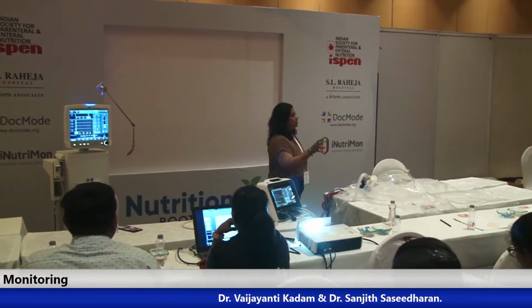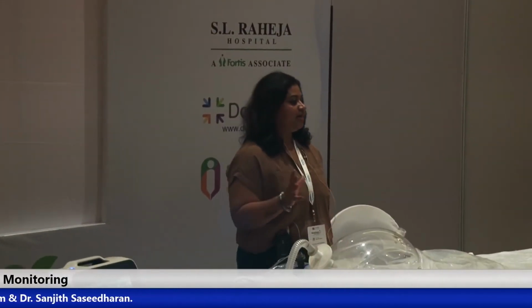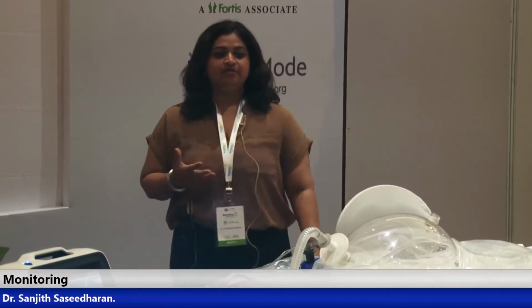Has anybody worked with it or seen or heard about it? Okay. What is indirect calorimetry? So something which will judge the calories, it doesn't judge, but it estimates and measures the calorie. That's the difference. Okay. What we usually do is we predict the calories.